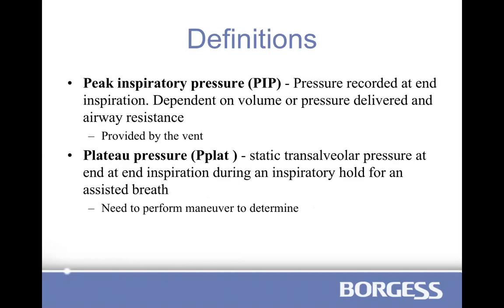So it's good to remember that ventilators, as we now know them, are all positive pressure ventilators. This is not the days of the iron lung. The iron lung was a negative pressure ventilator system that did not require the patient to be intubated, and that is a very different type of mechanical assistance. So the only thing that we are talking about today is positive pressure ventilation.